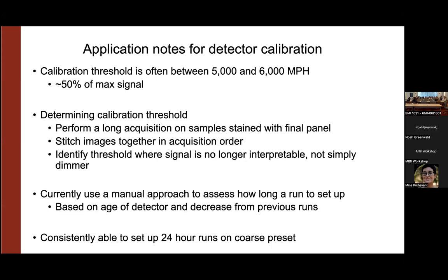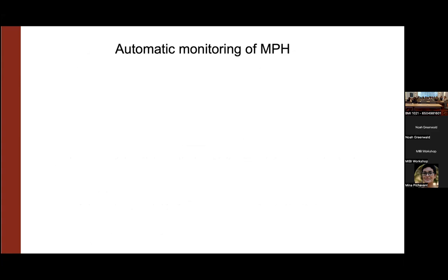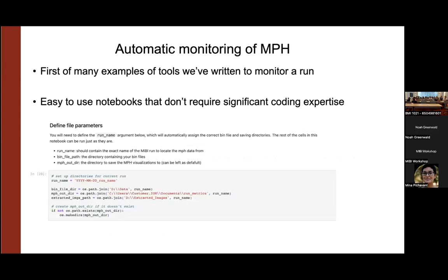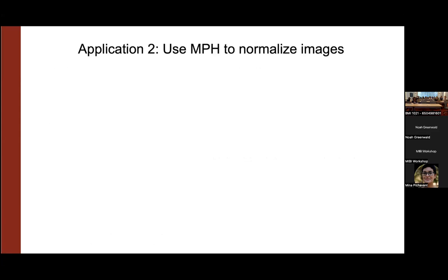And so with this current framework, it's not perfect. There's a fair amount of bespoke user intervention, but the result is actually much less user intervention once you've started your run. And so for us, with these large cohorts that we've been talking about, it's a really good trade. As I mentioned, we have a notebook that will basically take care of all the details for you. It doesn't require much coding expertise. Once you set up Toffee, this is just baked into it. You basically just say, here's the name of my run, here's what I want to measure, and it'll make those plots for you automatically.